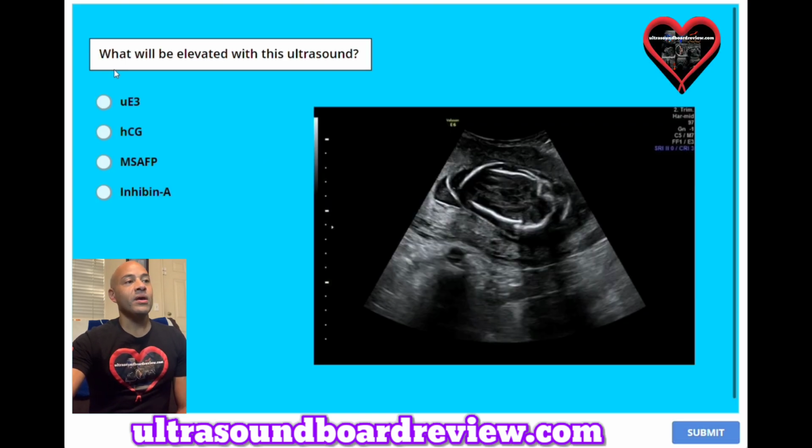Question number 3. What will be elevated with this ultrasound? A. UE3, B. HCG, C. MSAFP, or D. Inhibin A?